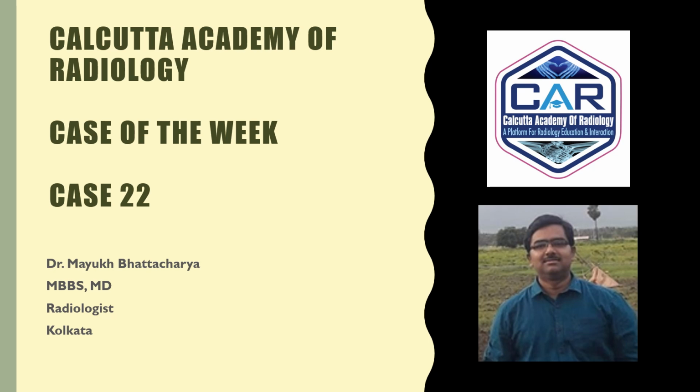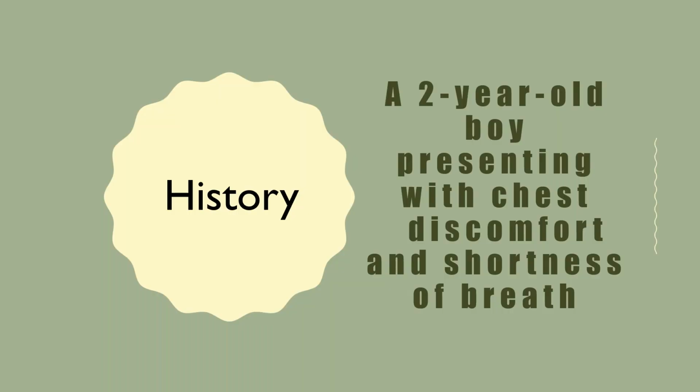Here is another interesting case by Dr. Mayukh Bhattacharya, who is my colleague. This is a 2-year-old boy presenting with chest discomfort and shortness of breath.